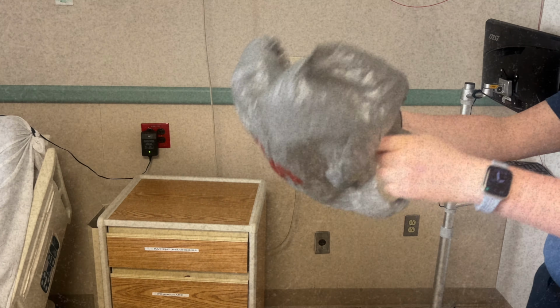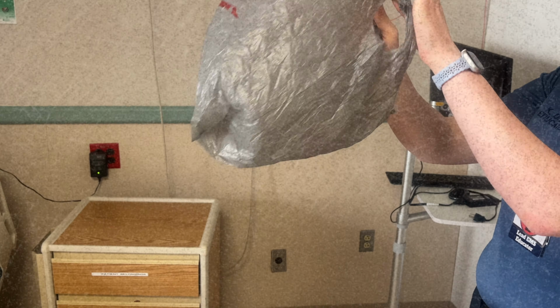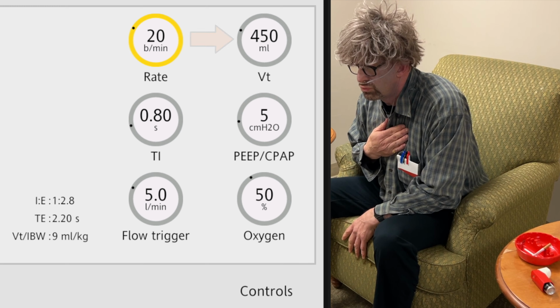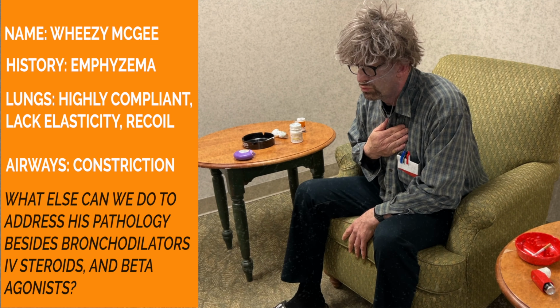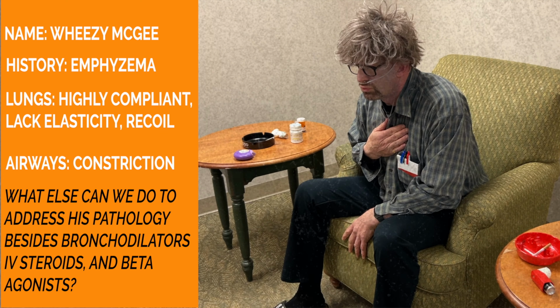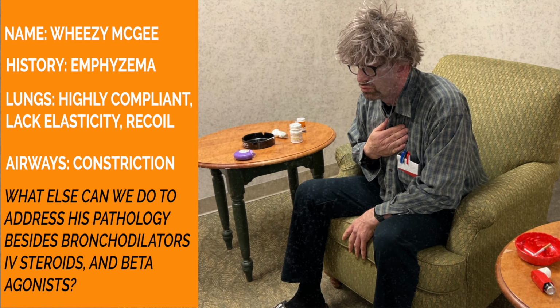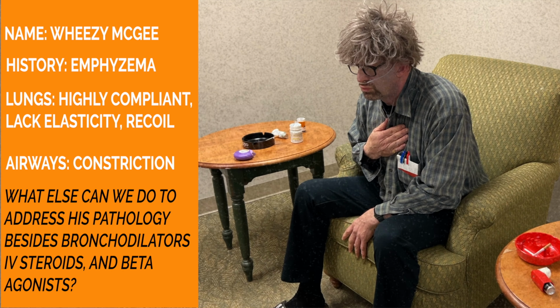Since Mr. McGee's lungs have the recoil of a plastic shopping bag, the tidal volume of 450 milliliters per breath, or 9 milliliters per kilogram, is acceptable. What else can I do to address Wheezy's pathology besides inhaled bronchodilators, IV steroids, and beta agonists? I can change other ventilator settings.